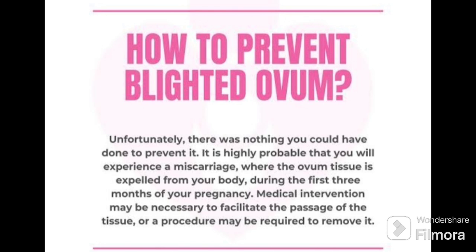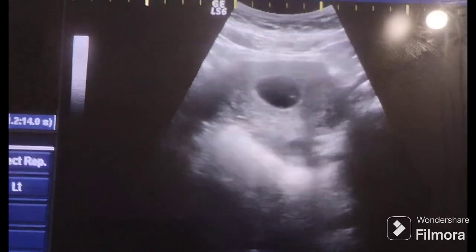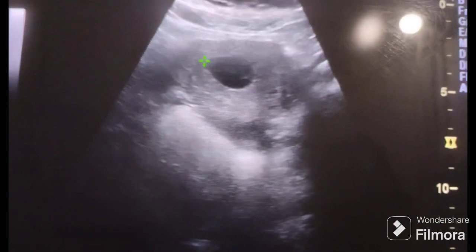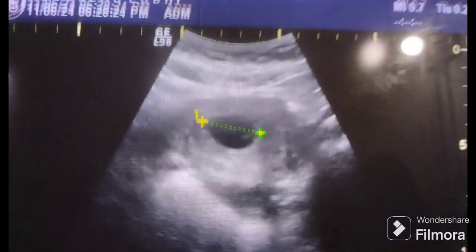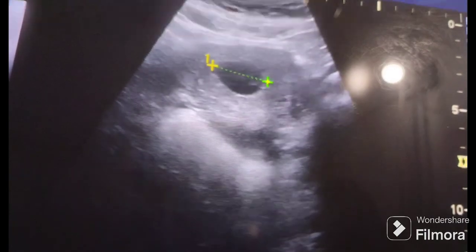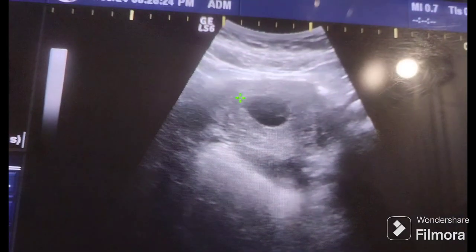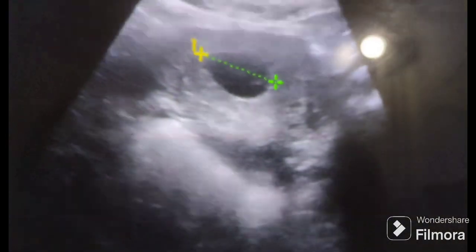Now I will show a case of blighted ovum. Please look at this video. There is a uterus containing a jet-black area which is called the gestational sac, but this is a totally empty gestational sac. This patient presented with a history of amenorrhea of three months, but there is no cardiac activity and no fetal pole. The uterus is enlarged and contains a large gestational sac which is totally empty, so we will say this is blighted ovum.